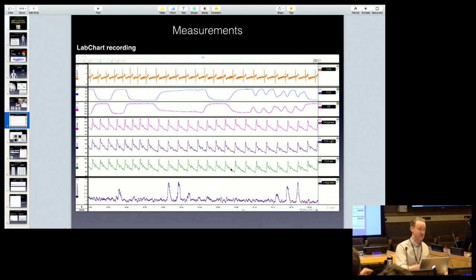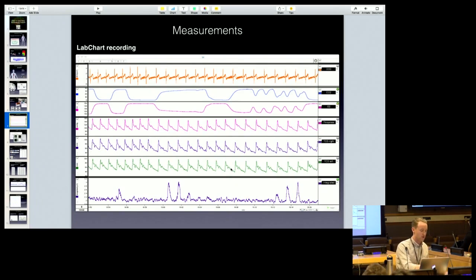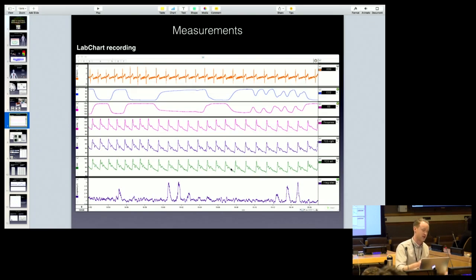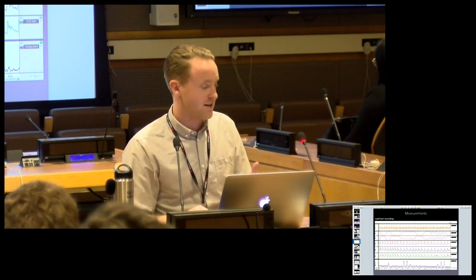Here's a close-up of the measurements we make. Everything is recorded to a program called LabChart and is all time-aligned together - we've got the ECG trace, CO2, oxygen, blood pressure, brain blood flow channels, and nerve activity which corresponds to the constriction of arteries.